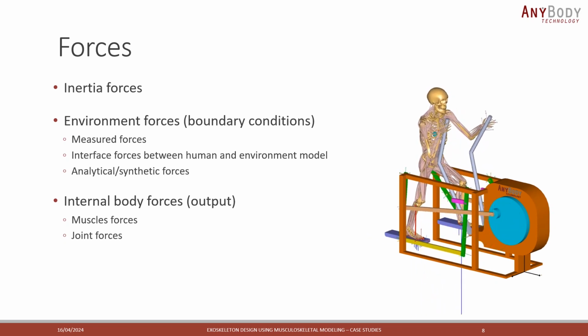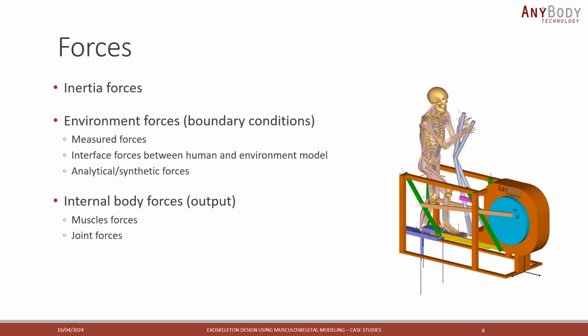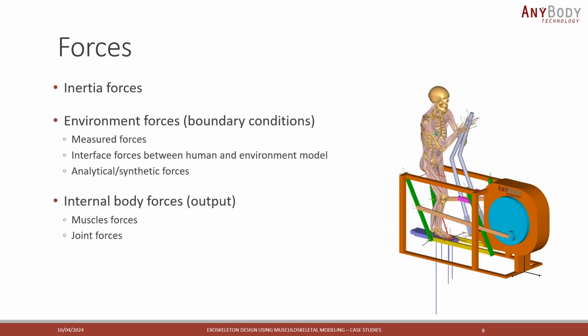And finally, the internal body forces. This is an output of the inverse dynamic simulation that tells us what is going on inside the body. Here we are looking at muscle forces and the joint reaction forces.